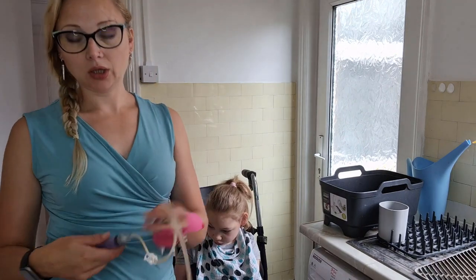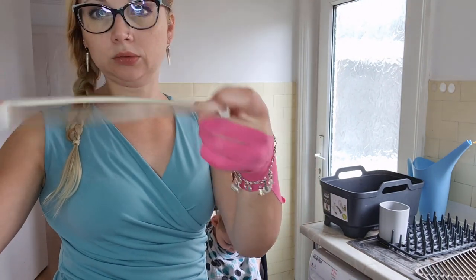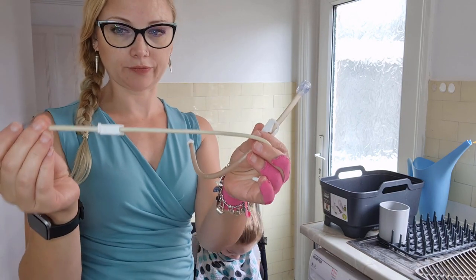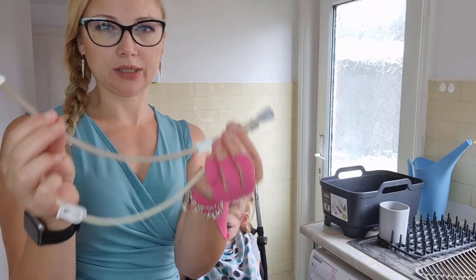These are the two tube extensions that we have. We have a thin one for milk and water, just plain fluid, and we have a thick one for her food. She's on blended diets.